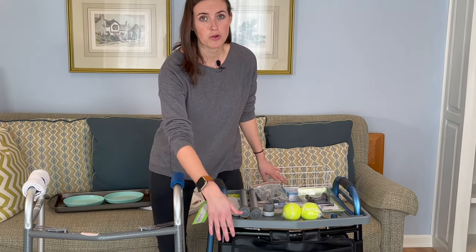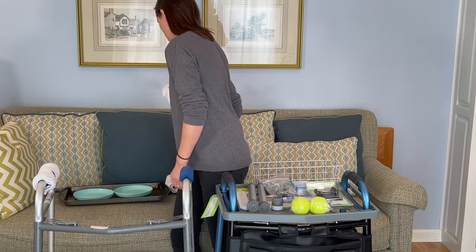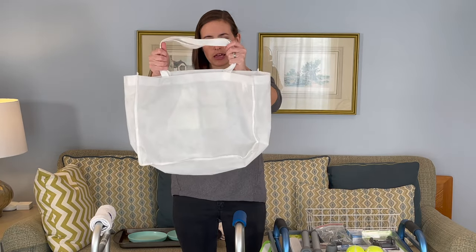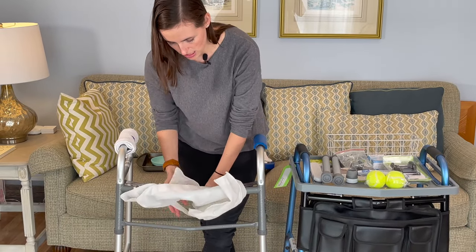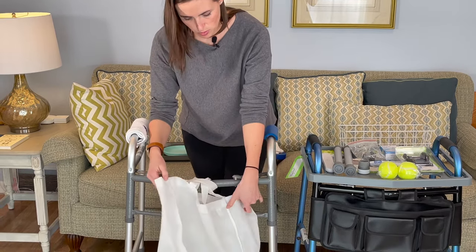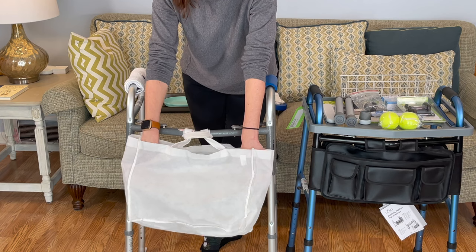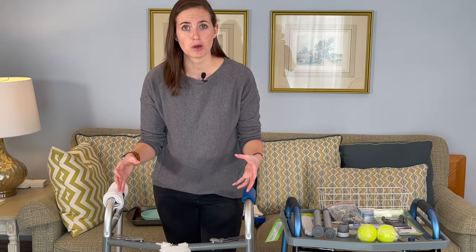If you don't have the walker basket or bag — which will set you back between $20 and $40 depending on the bells and whistles — you can make your own. A simple reusable shopping bag works great. You want one that's slightly wider than it is deep, because the depth will make it harder to reach down and grab things out of it. You just take it, wrap it around the handle, and it's not going to be nearly as beautiful as the matching Nova bag, but it's very practical — and by all intents and purposes, it was free. Now I can put the items I need to transport — my cell phone, a water bottle, things like that — in there, so I'm not having to figure out how to carry things when I walk with my walker.